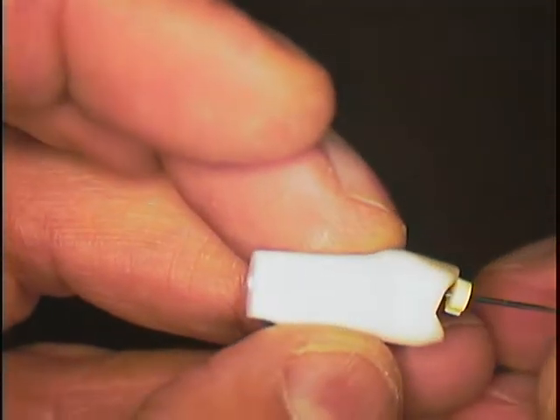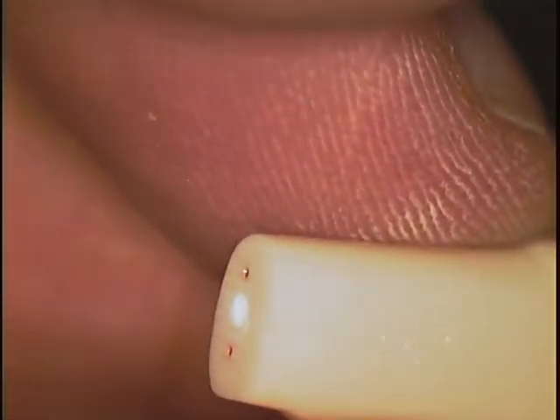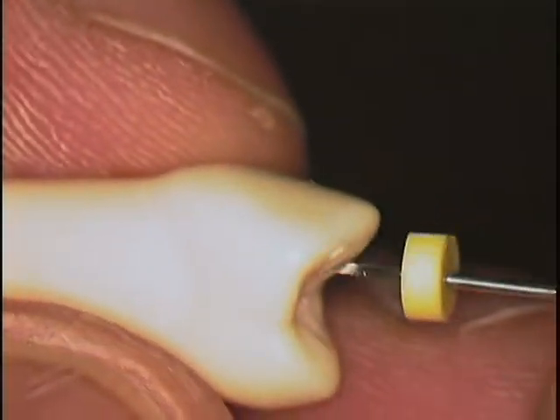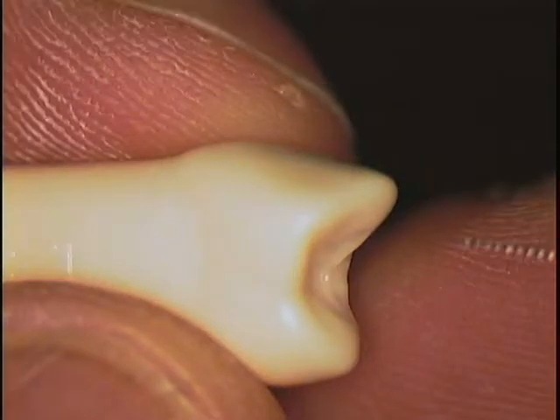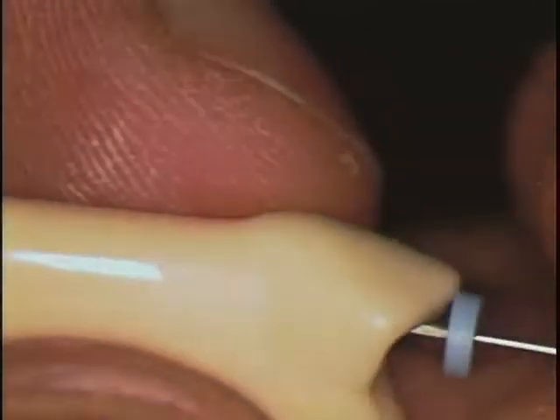Does it pass out the end? It does. So that apex is larger than a 15. So I learned that. There's no resistance. So this one's coming out. I'm going to put that one back. I'm going to take my patency file and recapitulate and back step. I'm going to go right back in, push it in there, recheck it, no problem, it's patent. Put that file back. Go to the next one, which is a number 20, which is yellow.